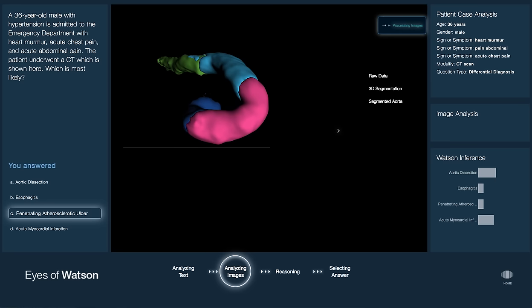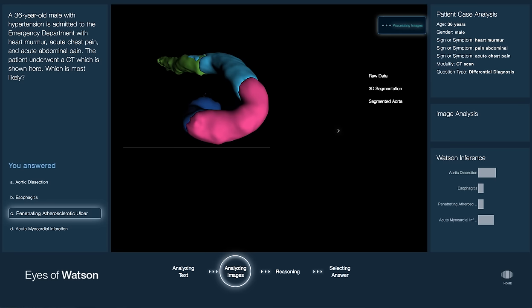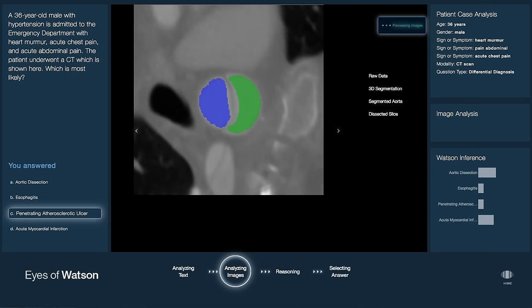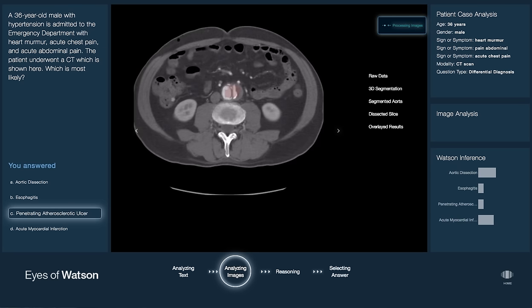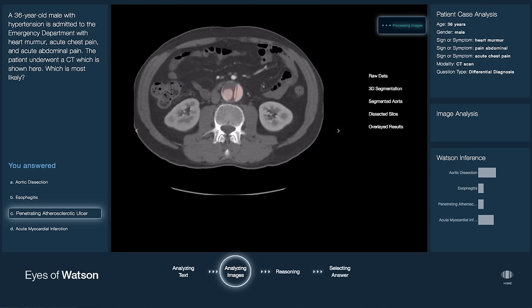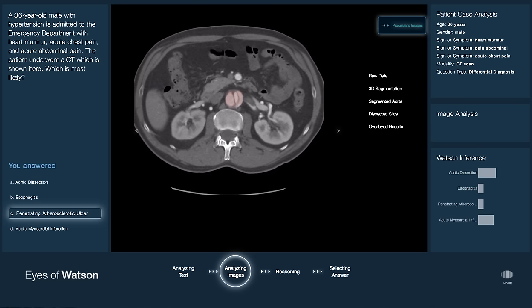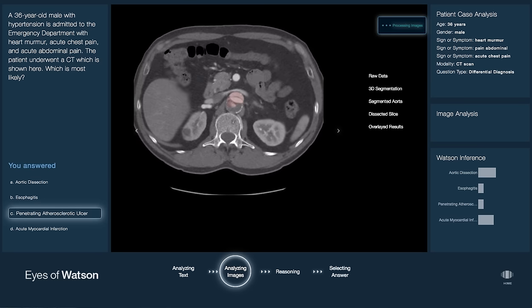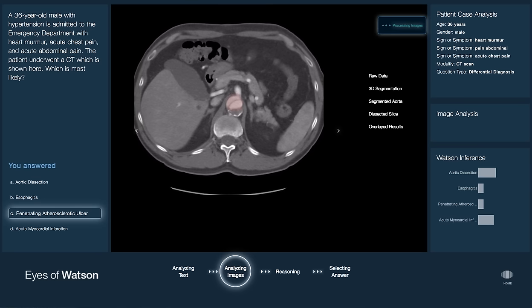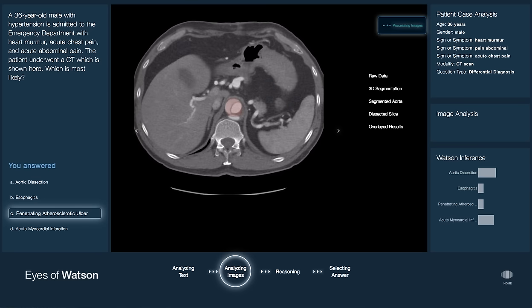It then looks systematically at each anatomical structure, such as the aorta, and observes an anomaly of dissection. The detected dissection is placed in the context of the 3D CT study, and the region of span of the dissection is noted. Further, the type of dissection can also be inferred.